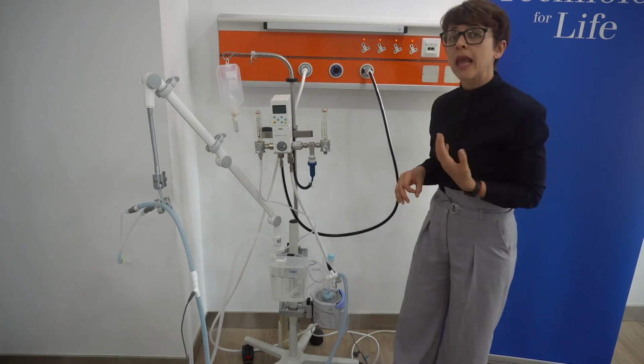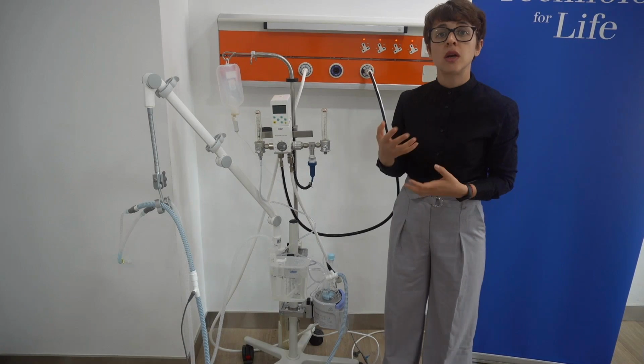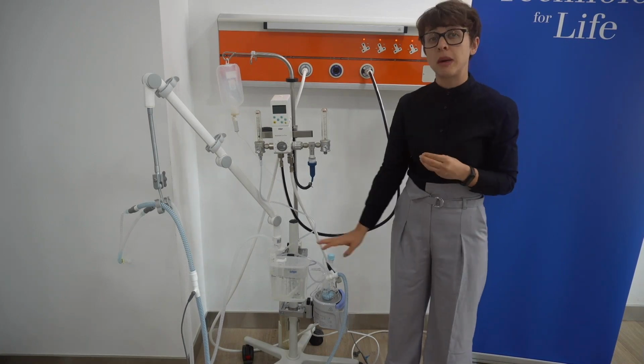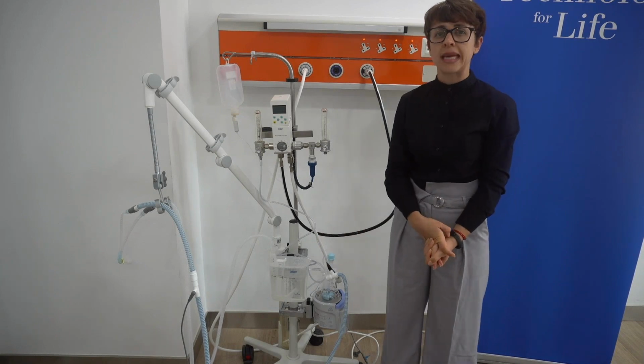And we already saw in some instances where babies are being delivered in labor and delivery, resuscitated, and then transported using the Bubble CPAP into the NICU if the baby requires a little bit of post-resuscitation respiratory support.